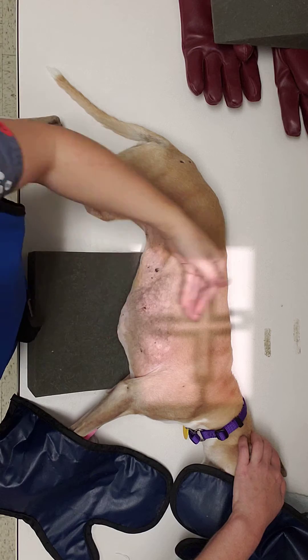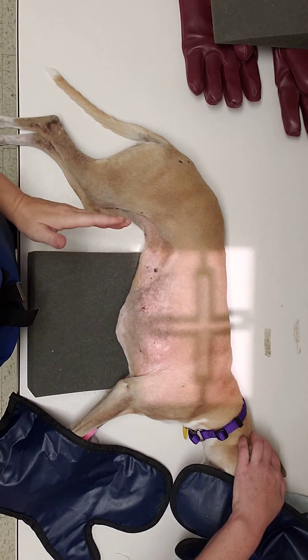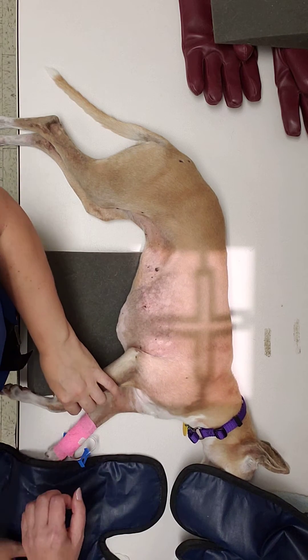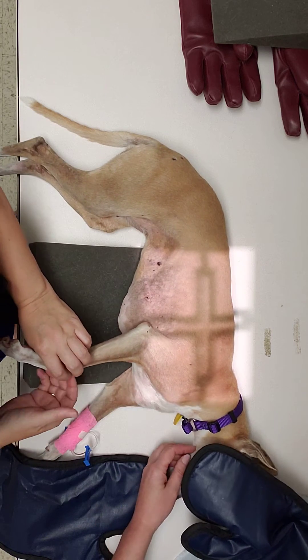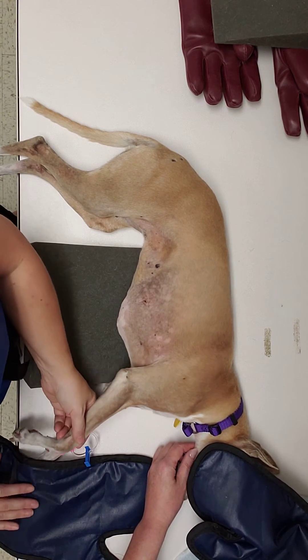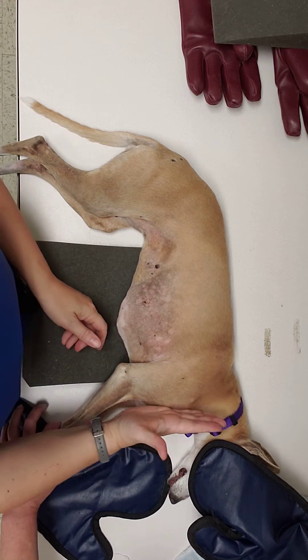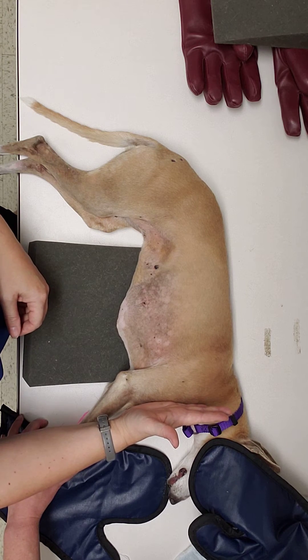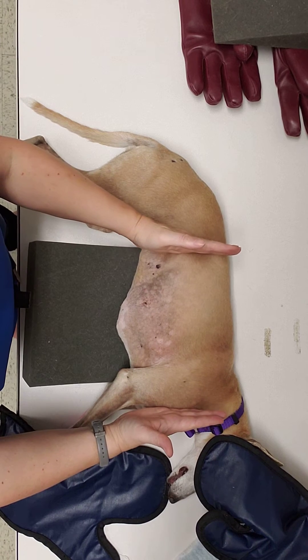Our collimation light is going to be equal to the thoracic inlet. The thoracic inlet falls about here — the manubrium and the shoulder joint. All of this right here is your cranial aspect of your collimation light.